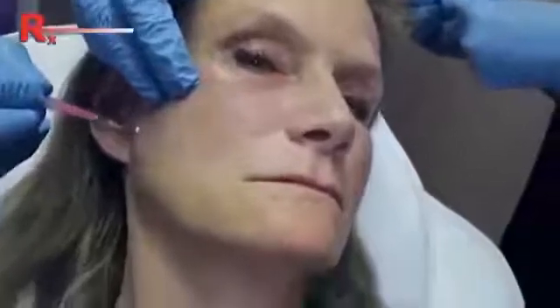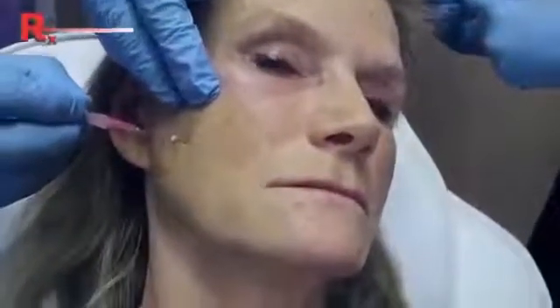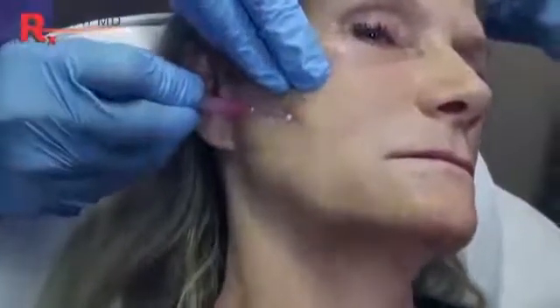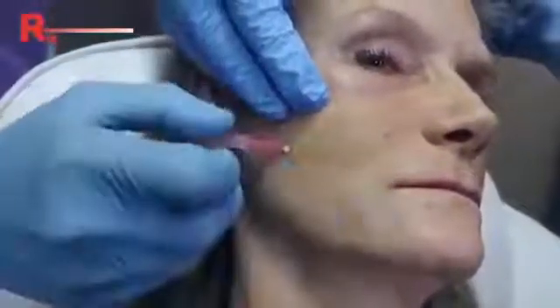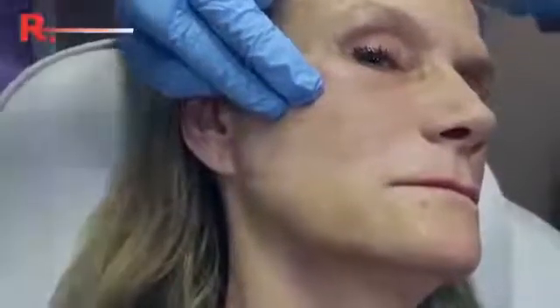Look for any vessels. I enter. I don't want to be too deep. And notice how I'm torquing this down. I'm using the flexibility, and I'm always going to keep a certain depth all the way through. Of note here, your parotid duct comes this way. You don't want to be deeper than that. We want to stay at a safe level.